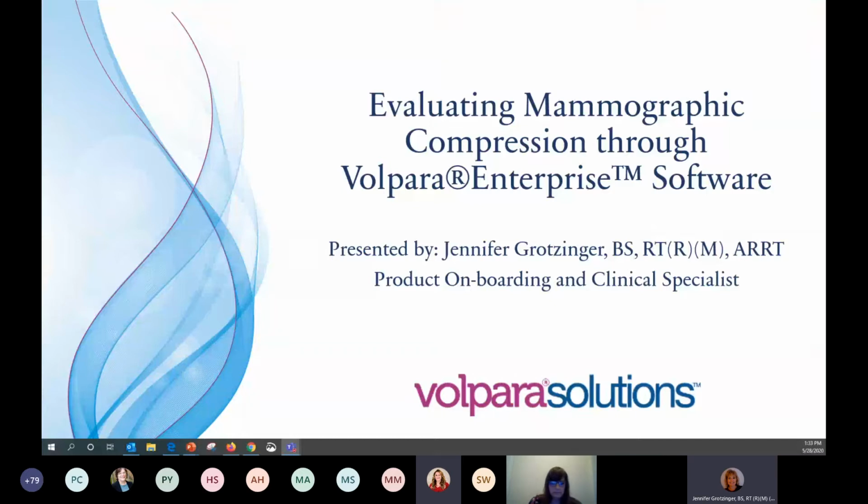All right, great. So thank you all for joining us today for our third and final Lunch and Learn presentation. Today I'm going to be covering evaluating mammographic compression through the VolparaEnterprise software. The majority of you have heard a lot of the data that I'm going to be presenting today, but I do hope this presentation is going to remind you of the importance of compression and how to understand your own compression behavior. So with that, let's get started.